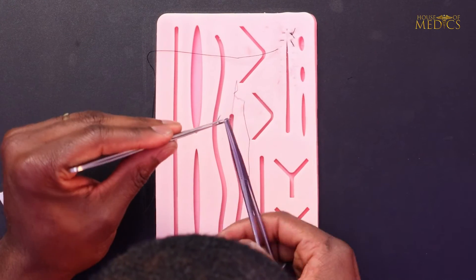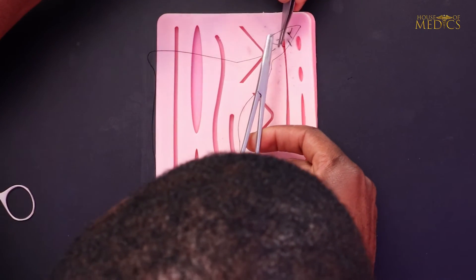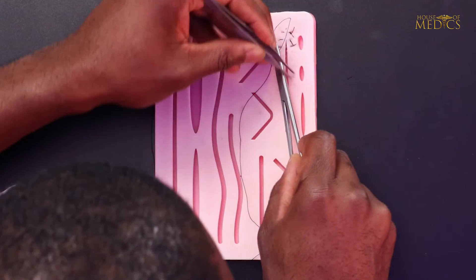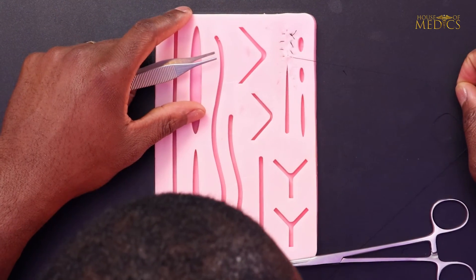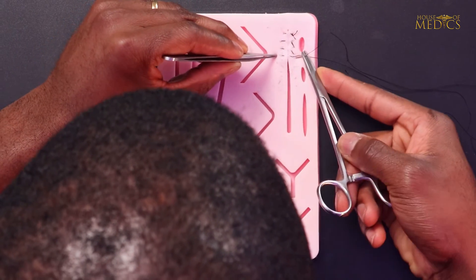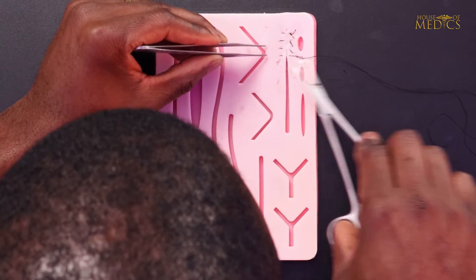Again, mount your needle to allow you to perform a backhand throw for the near-near. As you can see, the net effect of these sutures is a running vertical mattress that everts and opposes the wound edges. You can finish off suturing by tying a knot, throwing your final vertical mattress.